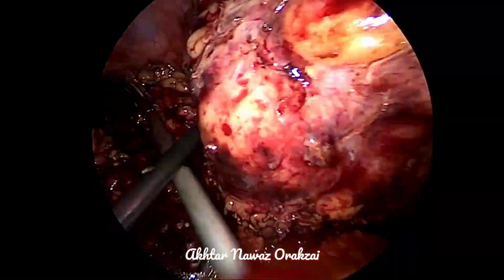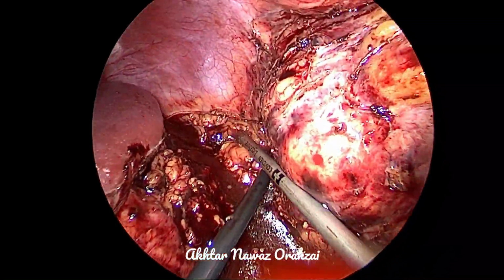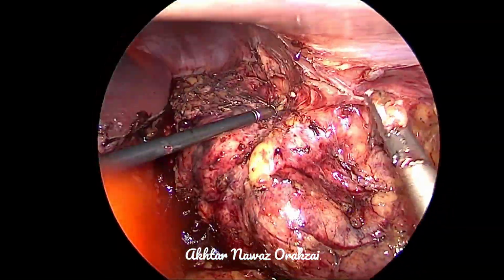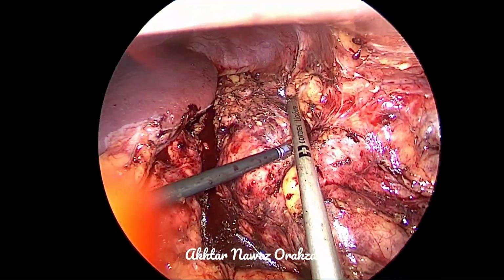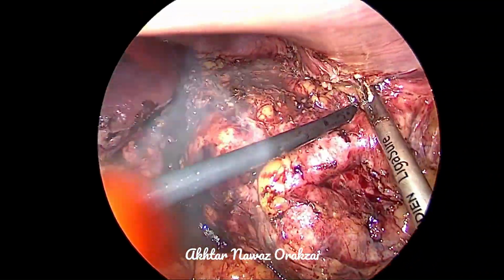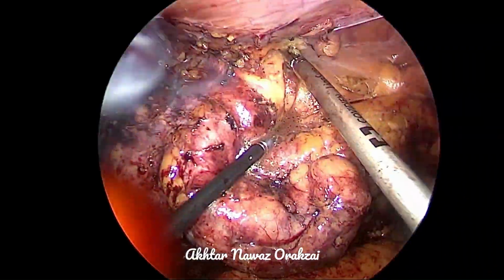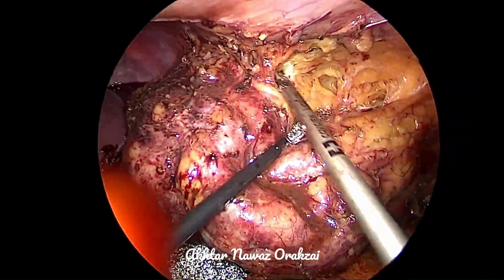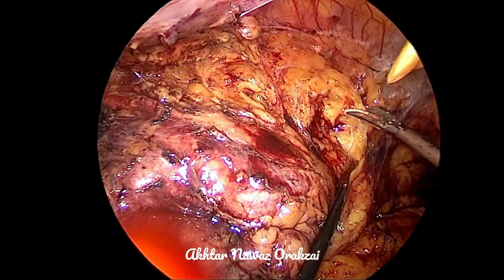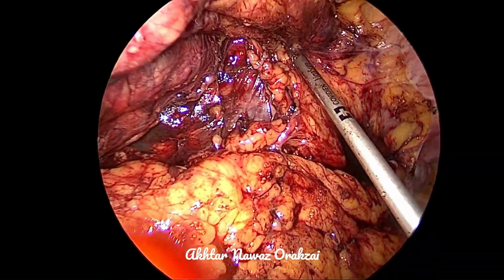So here you can see that the adrenal gland is also very badly stuck to the upper pole of the kidney, and during the process we have opened up the adrenal gland as well. However, it was inevitable. It is good that the pancreatic tail is saved. Here again, one has to be really careful and has to stay right on the kidney rather than on the diaphragm, because this area is so stuck to the kidney that dissection away from the kidney may lead to injury of the diaphragm.